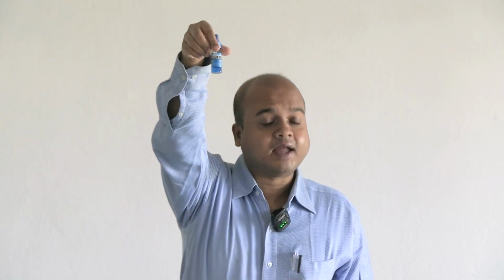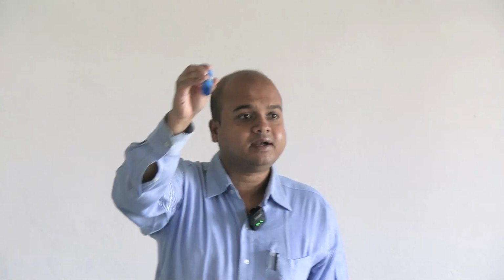This is not the natural agglutinin, this is just antisera artificially made, which will react with agglutinogen A, so it is called anti-A. This is not the same as the alpha agglutinin which is naturally present. This is anti-A antisera made from plasma. It may have some chemical features similar to alpha, the natural agglutinin, but it is artificially prepared from serum of human beings.